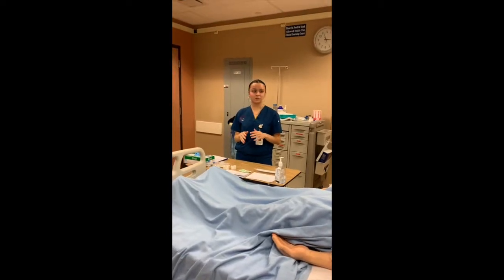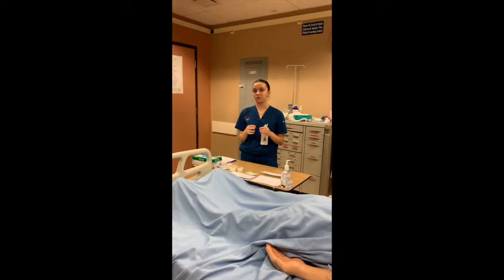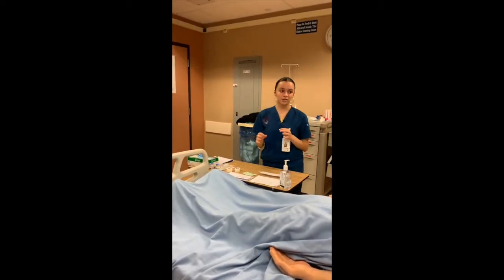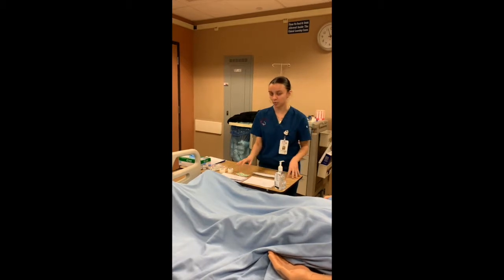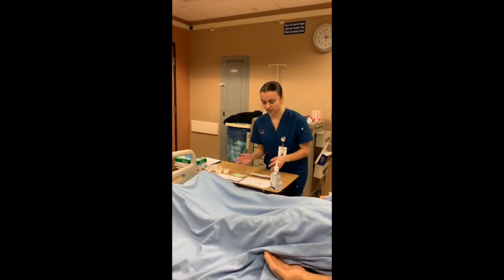Okay, so what we need to do first before we actually get started with the injection is to acknowledge the different safety checks, just to make sure that everything is according to protocol. So I'm going to double check Mr. Mario Mancini's MAR with the order, just to confirm that there are no mistakes or anything like that.